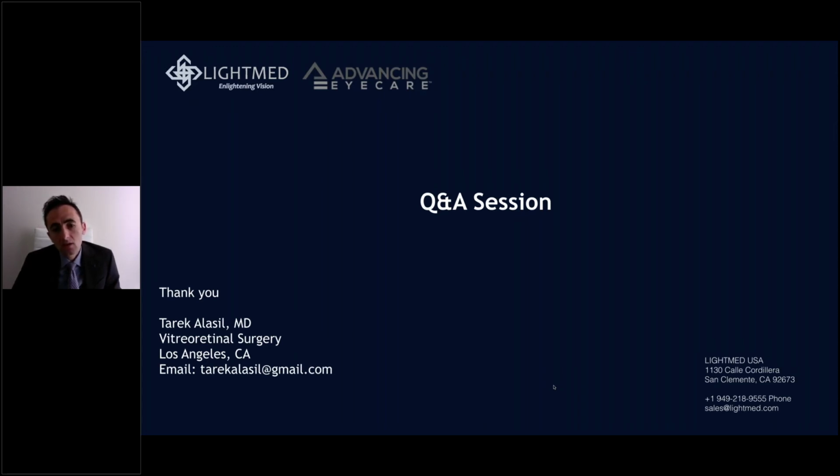Because when you have a retinal detachment or retinal break, you want a heavier laser that will target the outer retina rather than the inner retina. However, the scenario is totally different when you're looking at the macula, because with the macula, you want to preserve the outer retina and not cause any destruction in the outer retinal tissues. So this has been my experience with the two wavelengths.